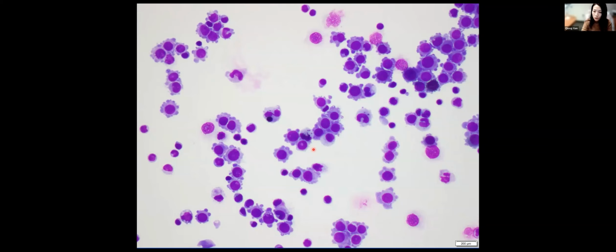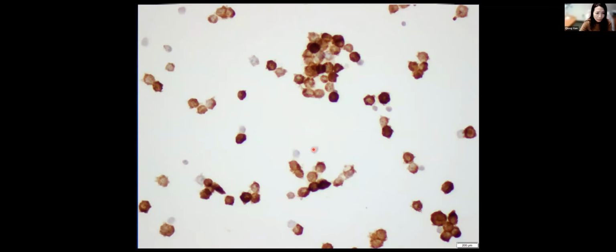The reason is that in our institution, regularly for CSF, we prepare two slides. One is Diff-Quik and one is a Papanicolaou stained slide. The Papanicolaou stained slide has been used for IHC. So in this scenario, there is only one IHC that I can perform, and this is the immunostaining. You can see here it has a good nuclear staining. So guess what it is? SOX10. Unfortunately, this patient was confirmed to have primary leptomeningeal melanoma, and the patient passed away in a few months.